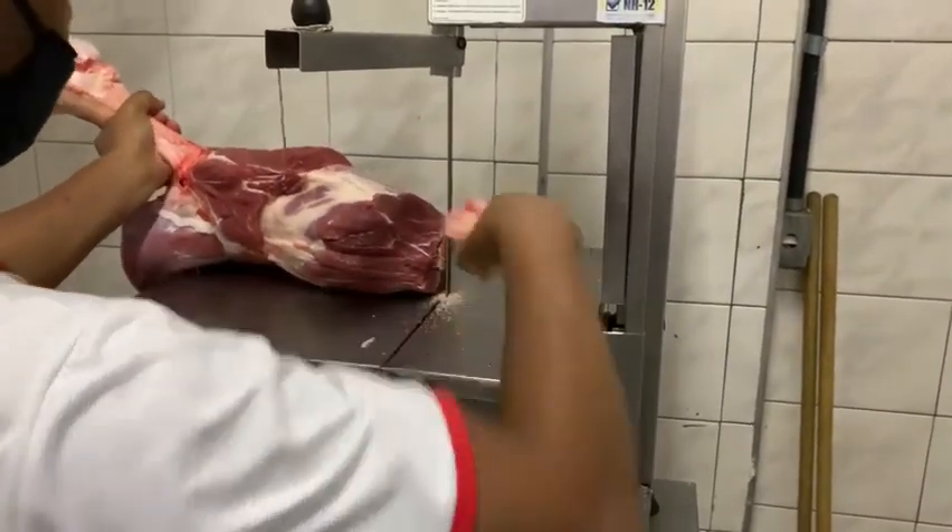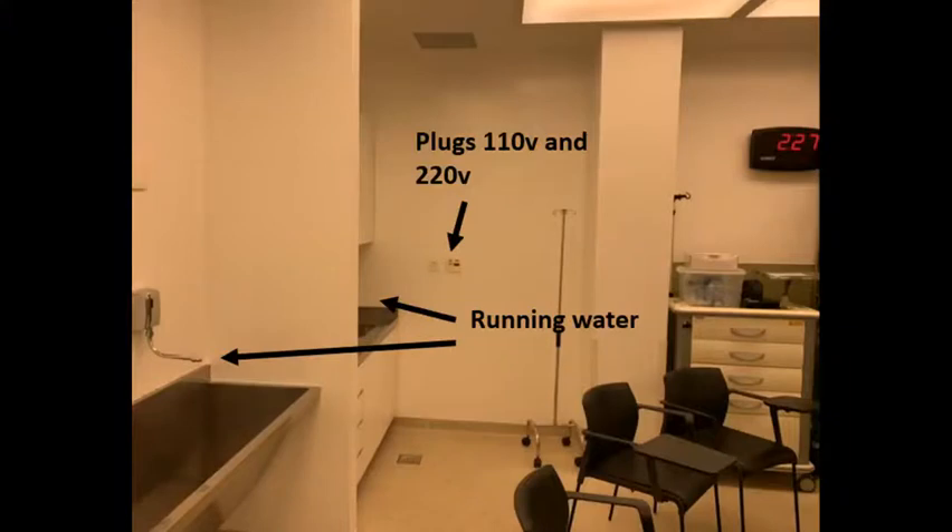The room for installing the lab must have plugs with 110 and 220 volts, a tap with running water and appropriate drains, and must have at least 20 square meters.